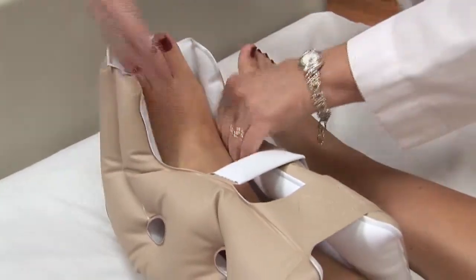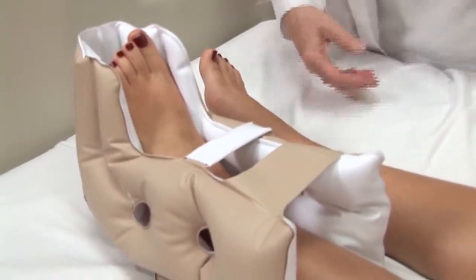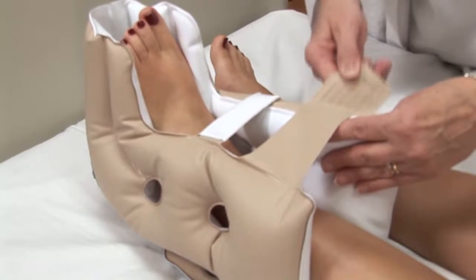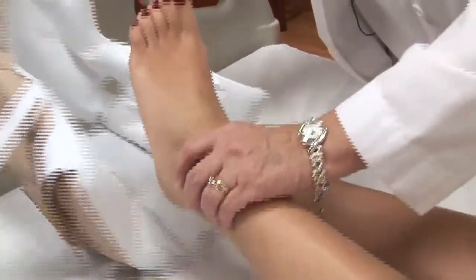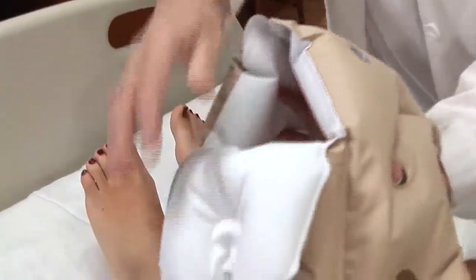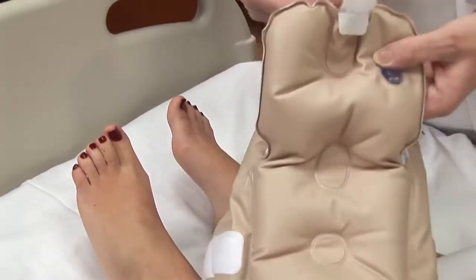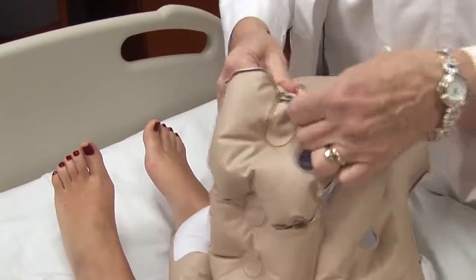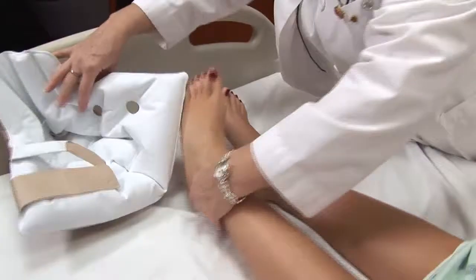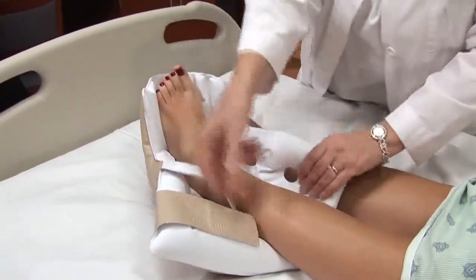Do the same hand checks to make sure that it is fitting you properly. If you have a patient who is agitated and moving their foot a great deal, you can take the boot off, remove the bottom strap, attach the tongue to the inside, and then replace the boot, to prevent them from digging their heel into the bed.